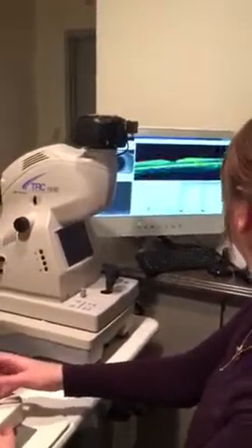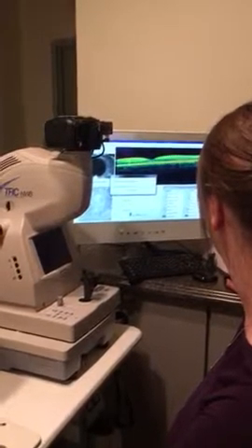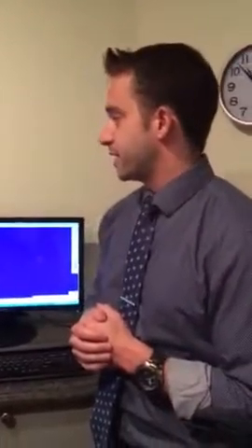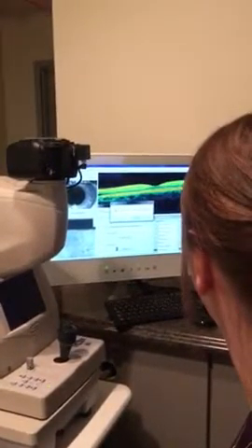Okay. Start again here. And once this is captured, we can see this is the area of our central retina, what we call the macula. So the part of the eye where you'll have diseases such as macular degeneration. Here you can see layer by layer how everything is, and with disease you'll see little bubbles or little deposits in that area. But luckily, again, for our patient Kia, it looks very normal. And these are basically just doing the same thing, retaking the image.